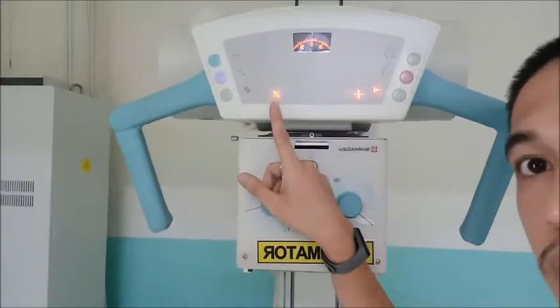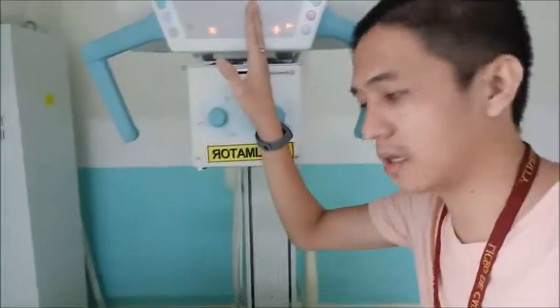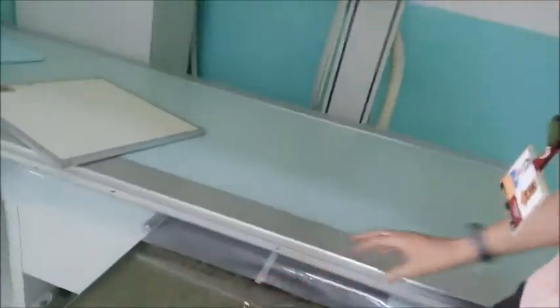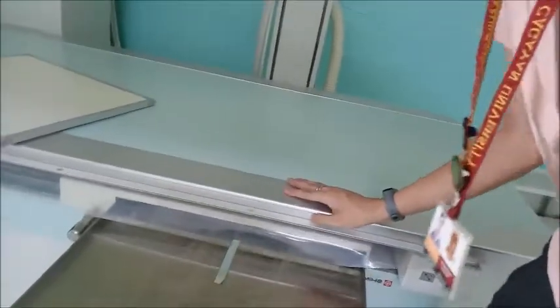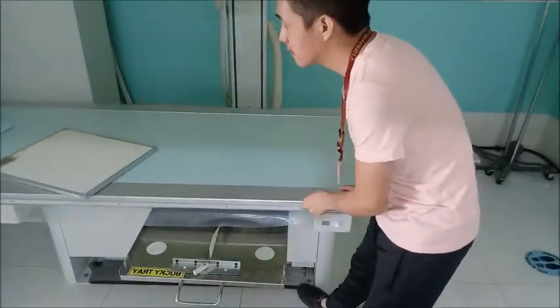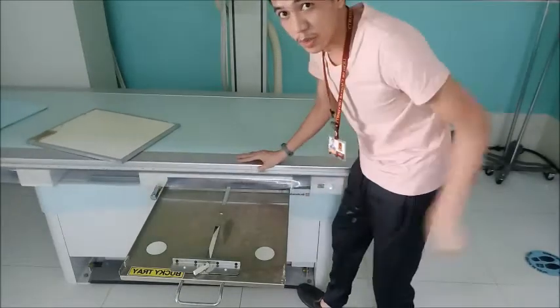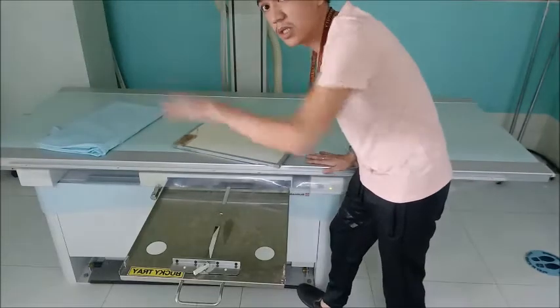This would signify that the tube is at the center of the table. You will notice that the table has a center. The table can be moved, toward here, toward the chest stand, and also toward the console.